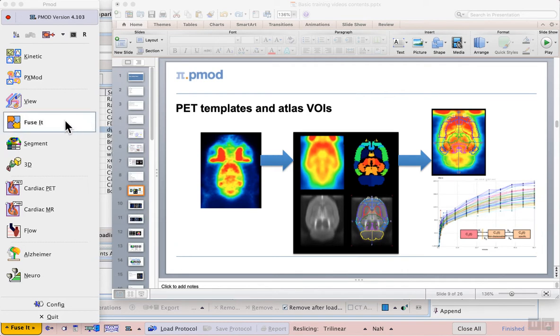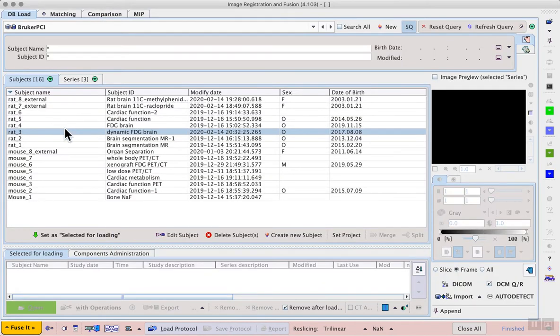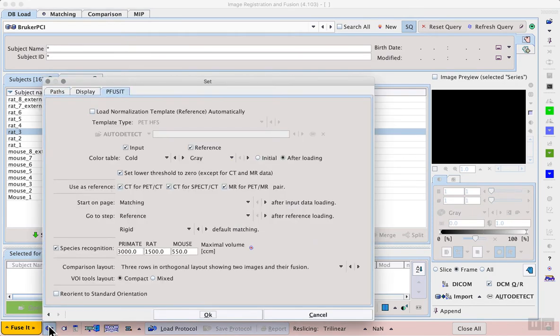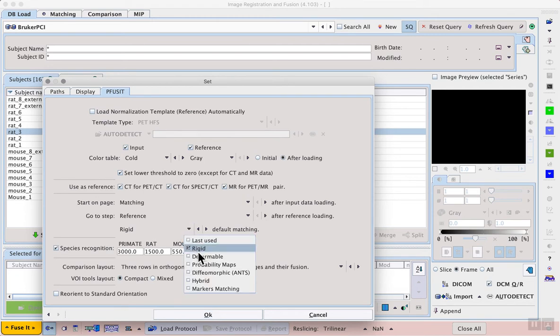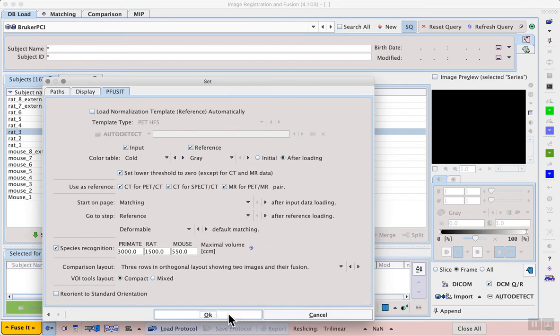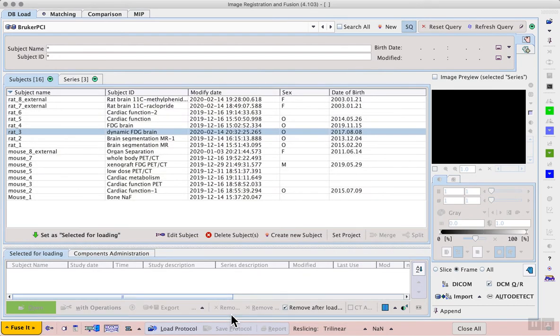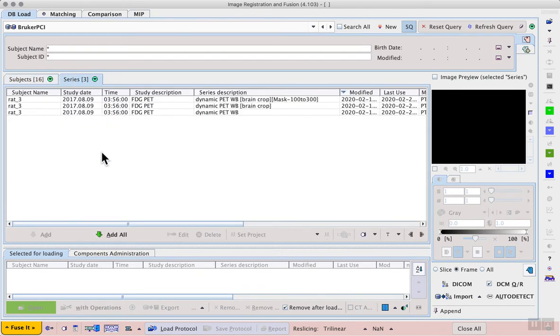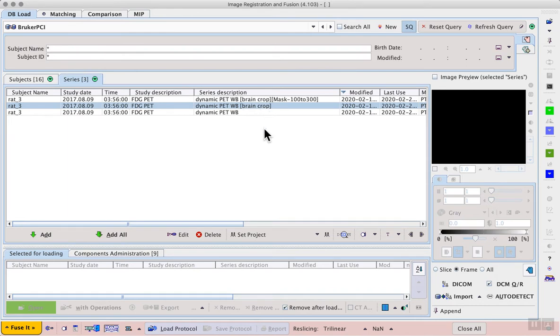We can start by opening the FUSE-IT tool, and in the configuration we will set the default matching mode to deformable. Next we select the data that we will work with, in this case from the Bruker PCI database, RAT-3, dynamic FDG brain. Then on the Series tab we can select the dynamic PET whole body that has been cropped to the brain, saving us some processing time in this example.